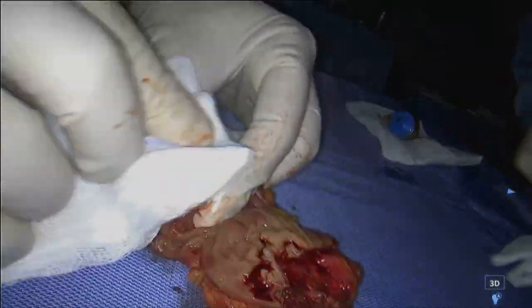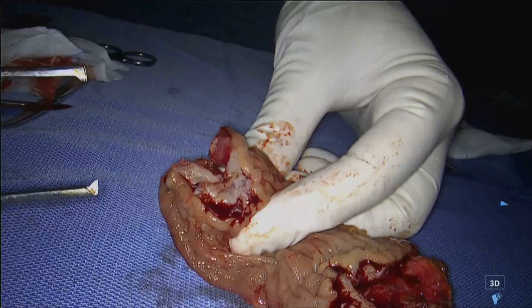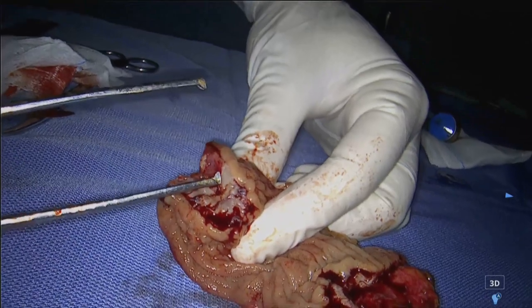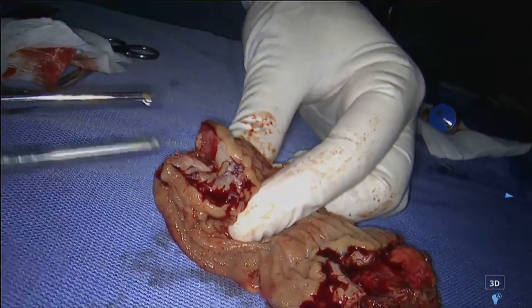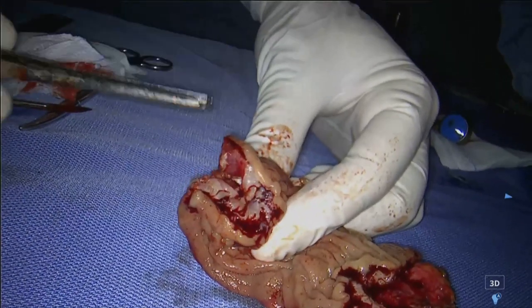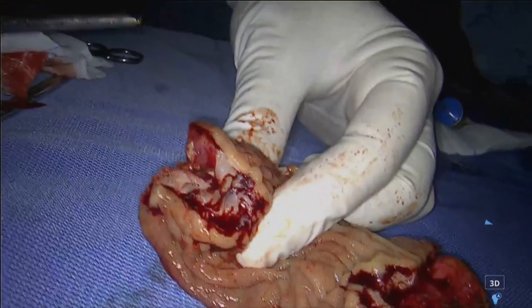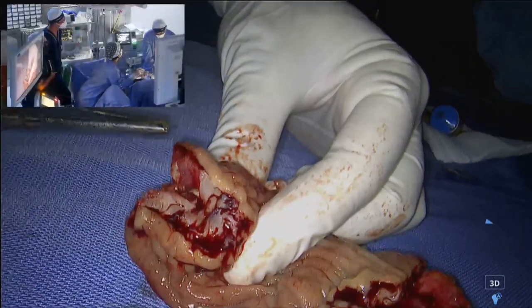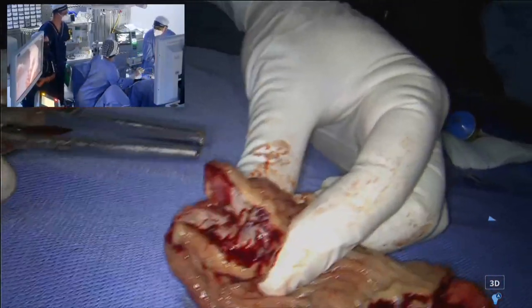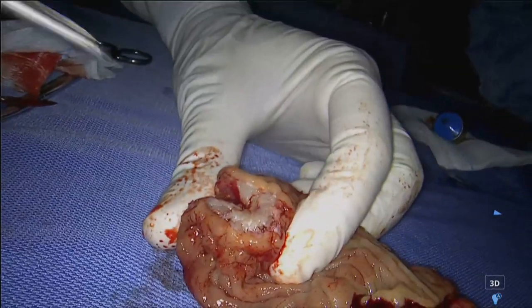And this is the big nodule. You see the big nodule is the white part, the avascular fibrotic part that infiltrates only the muscularis. The nodule grows inside the muscularis and increases the size and the depth of the muscularis of the rectum. Usually the muscularis is around 2 millimeters, and you see it very well by ultrasound. You see the normal aspect of the muscularis, and then you see the nodule, and you can evaluate the size of the nodule.